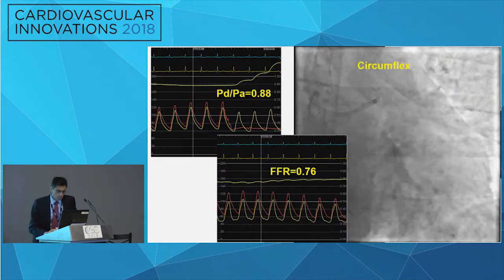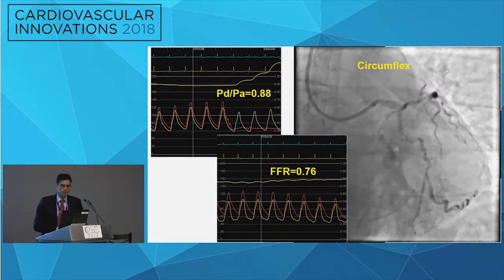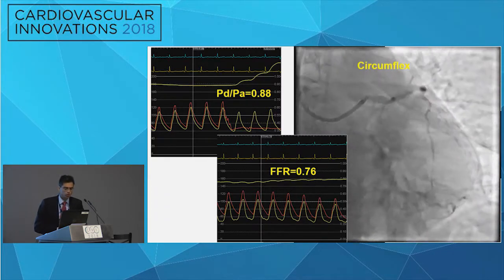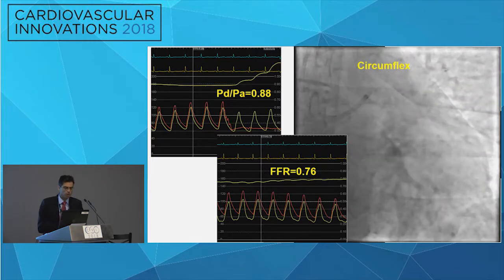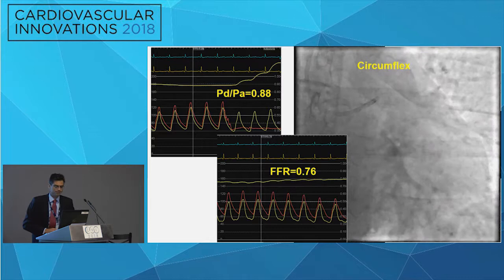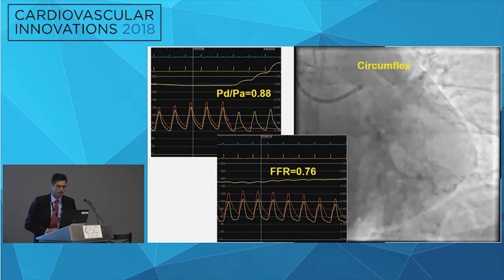All right? Well, let me show you some cases. I think the most information comes when you look at, I'll tell you my personal approach, both. And I think many of us have done both resting indices and FFR in the same patients.